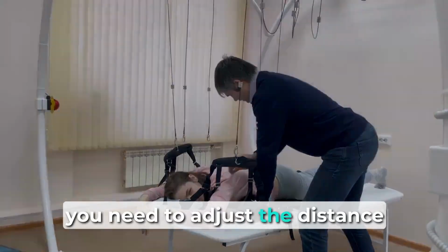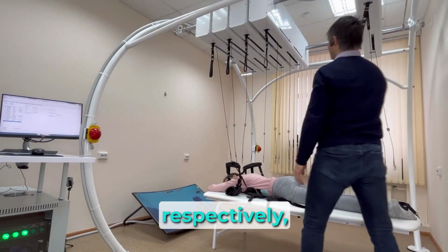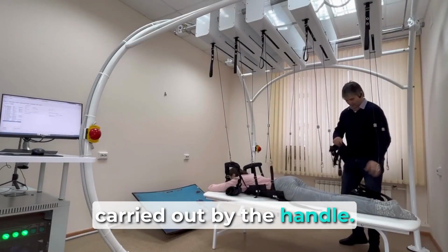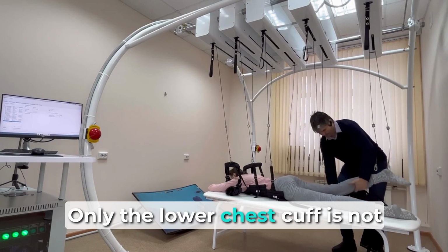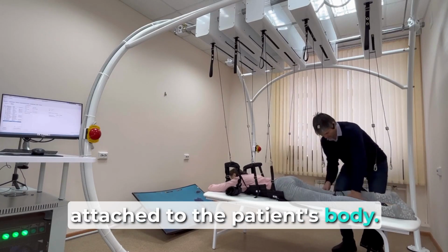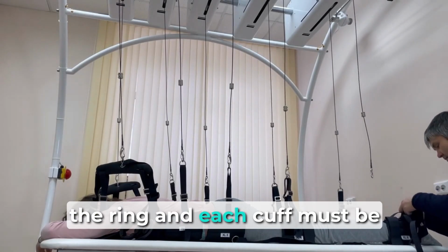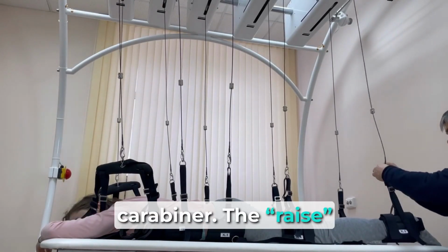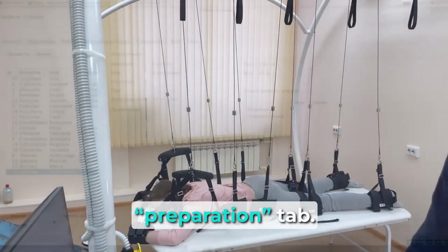Next, you need to adjust the distance between the modules, moving them so that the cables are positioned vertically, respectively, subject to the segments of movement of the modules, and carried out by the handle. The cuffs are secured to the patient's body. Only the lower chest cuff is not attached to the patient's body. After securing the cuffs, the ring and each cuff must be secured in the appropriate cable carabiner. The Raise button and the Lower button are located on a separate Preparation tab.